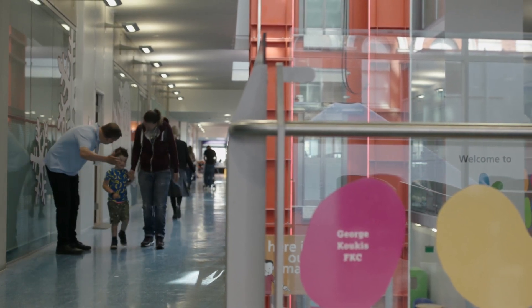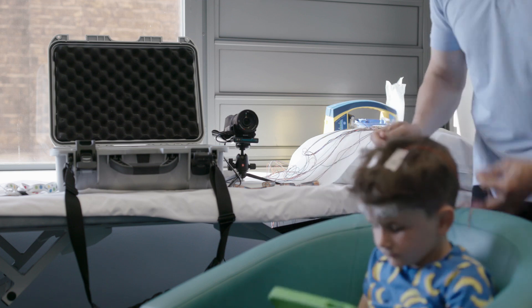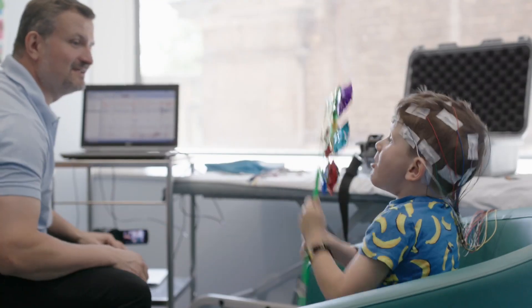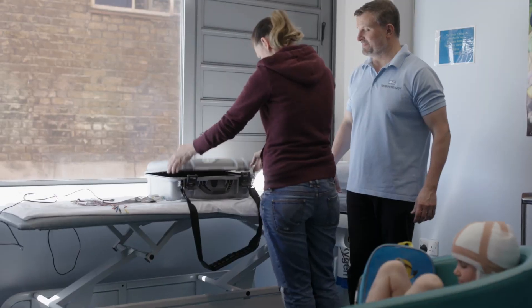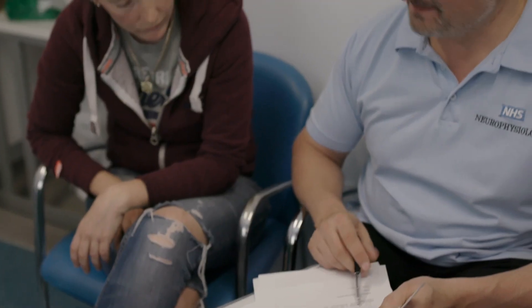Traditionally it's been done in hospital but now we can offer the service at home. The child comes in for an appointment just like a standard EEG. We take a full history, carry out some checks and then make a short recording.